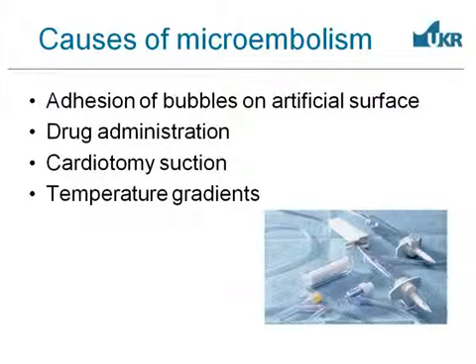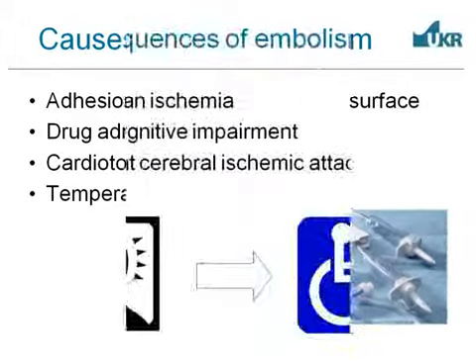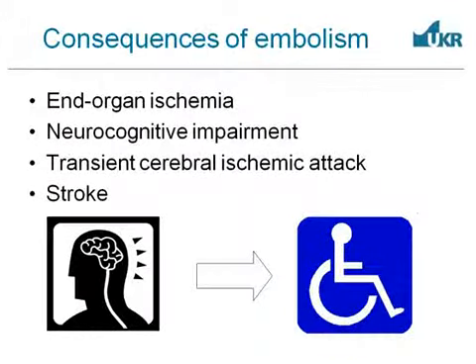There is adhesion of bubbles on artificial surfaces whenever you perfuse artificial circuits. When you infuse drugs, with cardiotomy suction and with temperature gradients, it's like opening a lemonade bottle. You always get some bubble problems. And as has been alluded to this morning, the consequences of emboli can be very manifold.